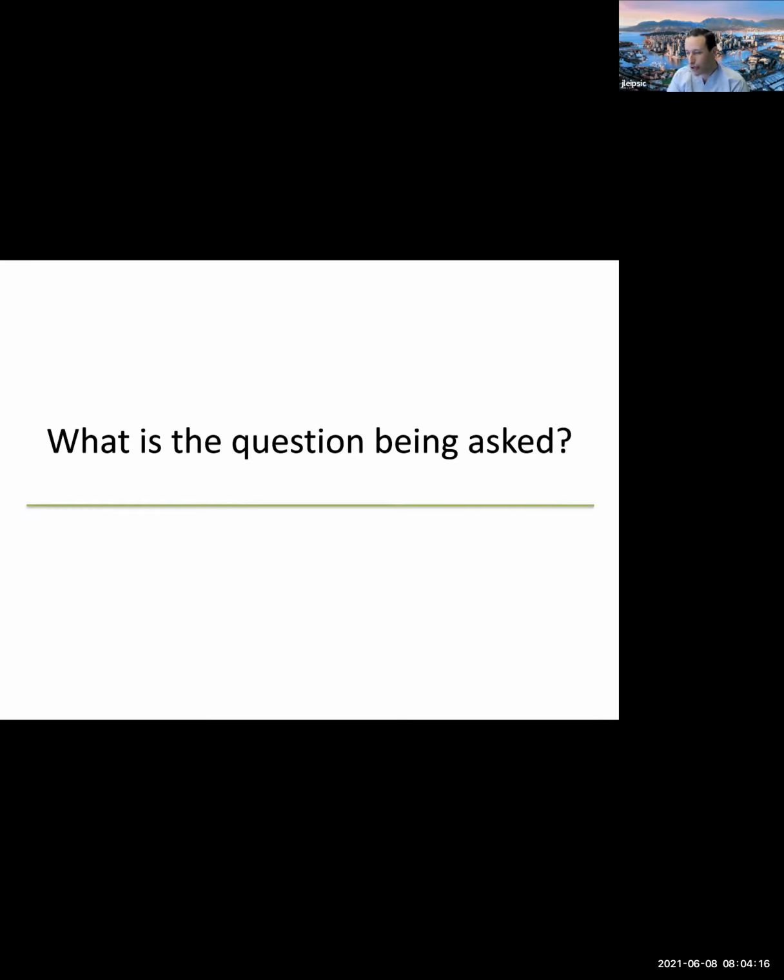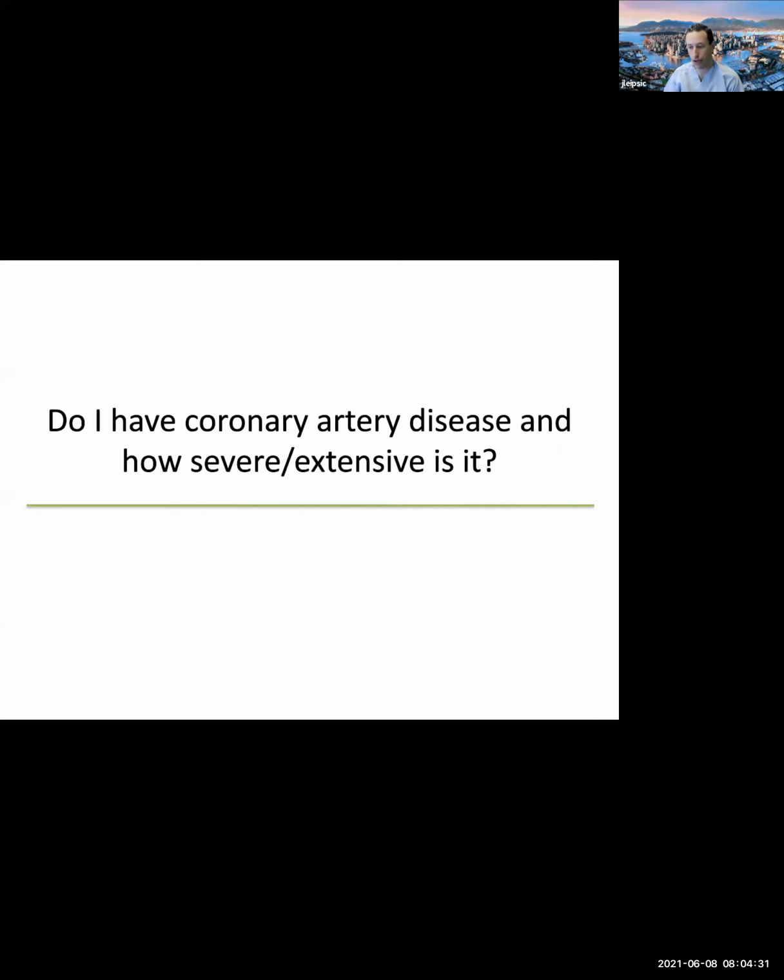So, I wouldn't argue that we should do cardiac CT in a patient where the clinical question is, what is coronary flow reserve? Or is there a regional wall motion abnormality at peak exercise? But I do think that if the question is, does the patient have or not have coronary disease, it makes a lot of sense to me to explore the non-invasive, safe opportunities to anatomically evaluate the coronary arteries with CT.